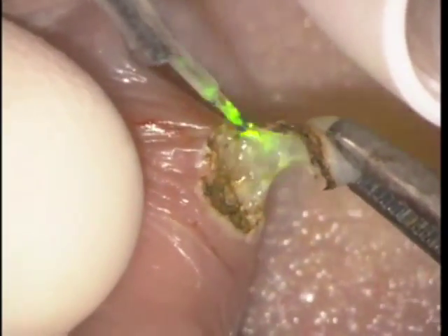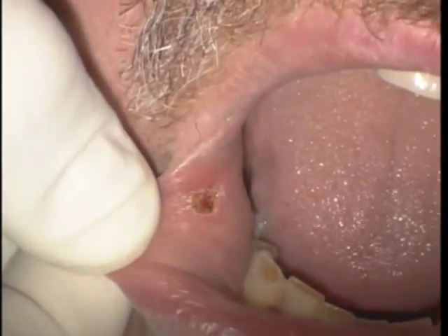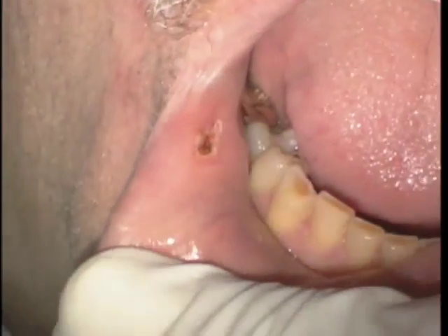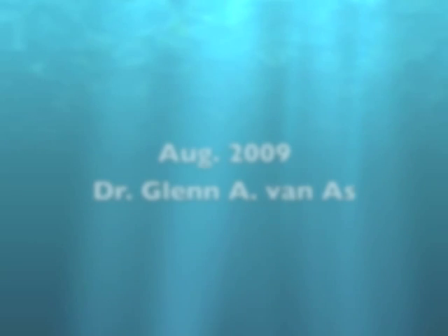After removal of the lesion, it's sent in to a pathologist and we use hydrogen peroxide to clean up the tissue. You can see at low magnification what the lesion looks like. This will heal in by secondary intention — it needs no sutures — and at high magnification you can see a small lesion, no bleeding, and a perfectly healed result will appear in roughly ten days to two weeks.